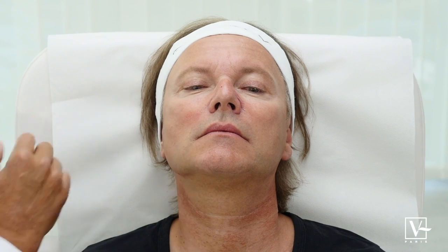Last but not least, when we age, there is a sagging on the midface that creates what we call the tear trough, the hollow eyes. So we're going to inject Stylage Double XL on the midface to reduce the distance between the eyelashes and the midface projection point by creating a convexity. We can also use Stylage L to make it more round and convex on the malar bone.